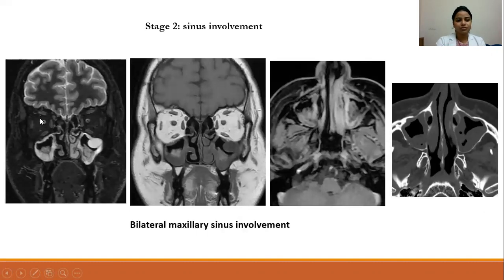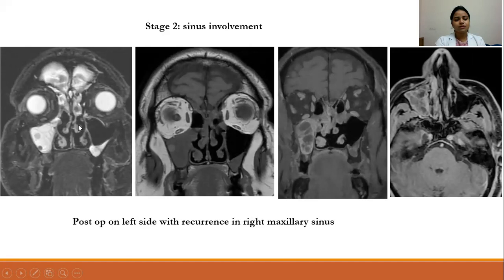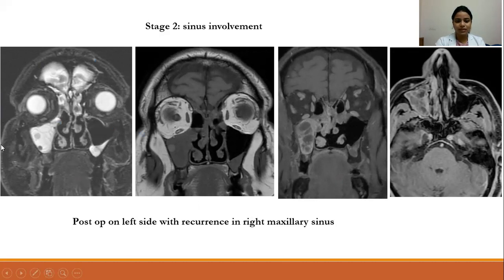Another patient showed polypodal mucosal thickening involving bilateral maxillary sinuses, with peripheral enhancement and a central non-enhancing area on post-contrast. Corresponding CT images showed bony erosions of the maxillary sinus walls involving the posterior wall, medial wall, and nasal bones. A post-op patient with recurrence on the right side showed polypodal mucosal thickening in the right maxillary sinus, with disease extending into bilateral ethmoid sinuses, and peripheral enhancement with a central non-enhancing area on post-contrast.